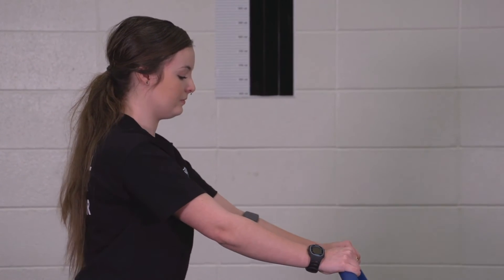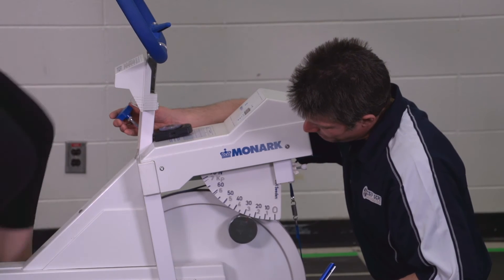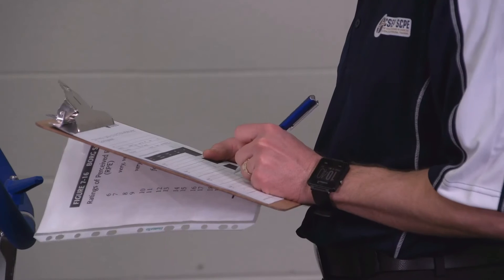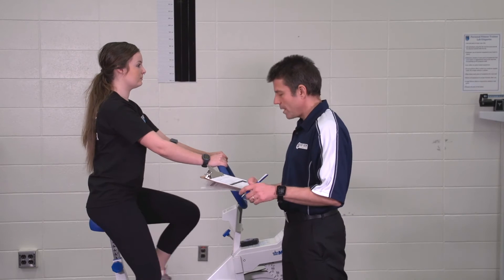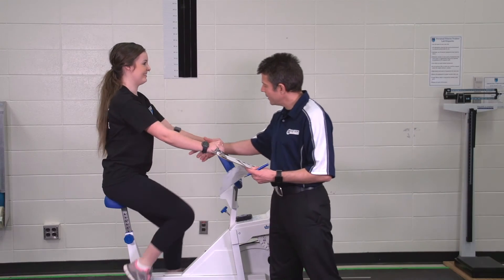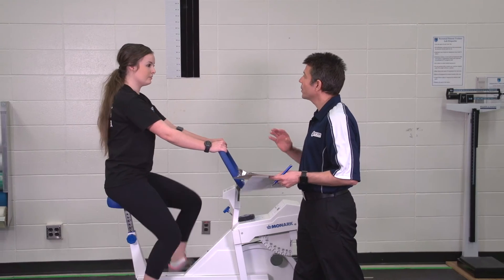So I'm now going to move you to 2.5 KP. Be sure to keep it at 50 RPM. Alara, we're at minute one — I'm going to check your heart rate. We're at minute two — let's check your heart rate again. Alara, we're at minute three — I'm going to check your heart rate. The difference between your last two heart rates was more than five beats per minute, so I'm going to go one more minute.